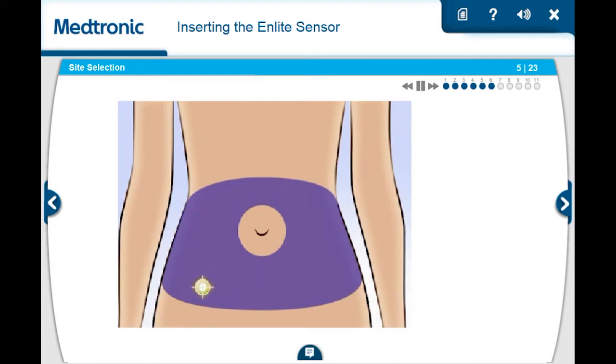For best glucose sensor performance, be sure to avoid sites where your clothing may rub or constrict, for example, your belt line. You should also avoid sites where your body naturally bends, or where there's a great deal of motion, and sites that are scarred or have hardened tissue or stretch marks. These sites are recommended for inserting the nLite sensor. Sensor performance may differ when other insertion sites are used. Be sure to rotate your sensor sites in order to avoid tissue damage that could occur from overuse.